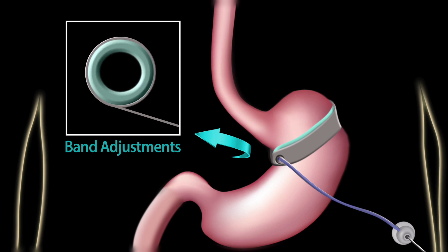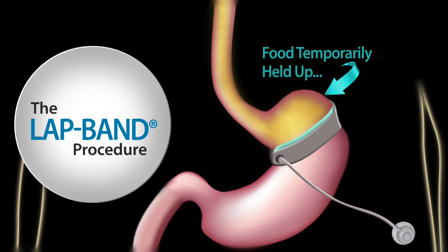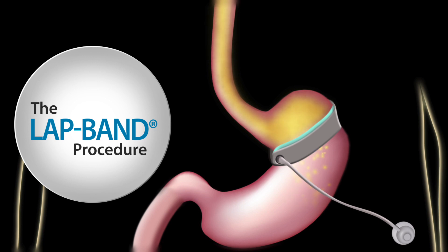The port is used to fill or empty a balloon that is on the inside of the band. This allows us to adjust the band — tighten or loosen — and control the rate at which each bite of food travels across the band to the lower part of the stomach. The lap band works because each time you take a bite of food, it gets temporarily held up by the band. The pouch at the top of the stomach fills, and the food stays there for about 30 seconds. The food then passes across the band into the lower part of your stomach.